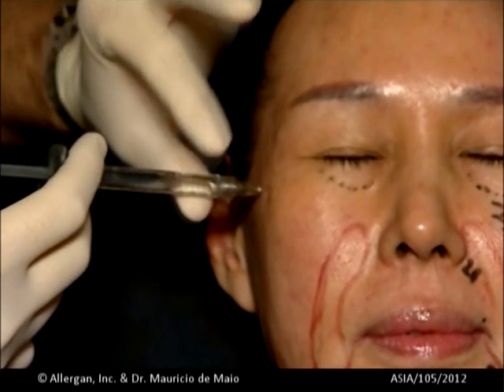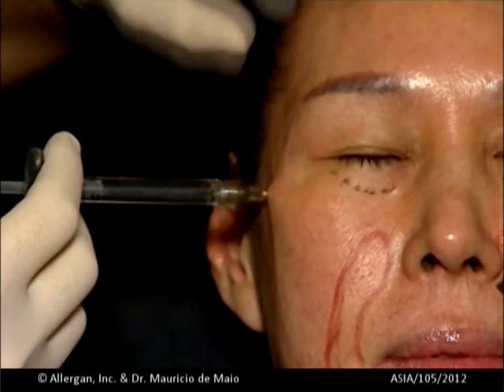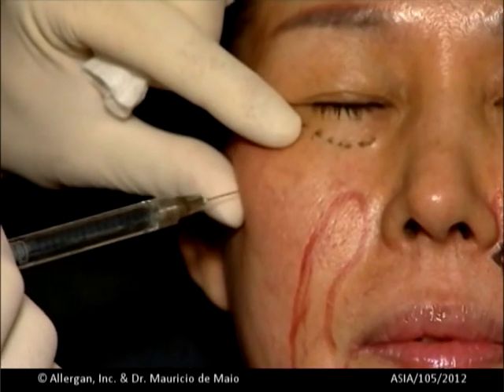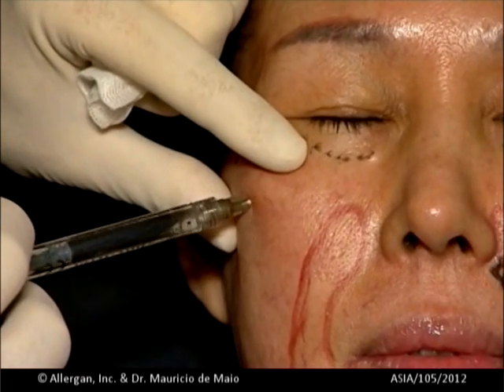Don't forget to aspirate, perpendicular down to the bone. A total amount of 0.1 is injected. Massage. Proceed to point number 2. Aspirate. From 0.2, from 0.3 total volume.